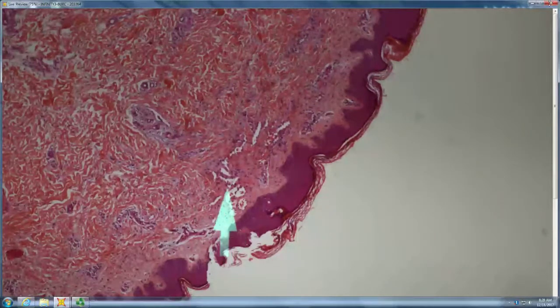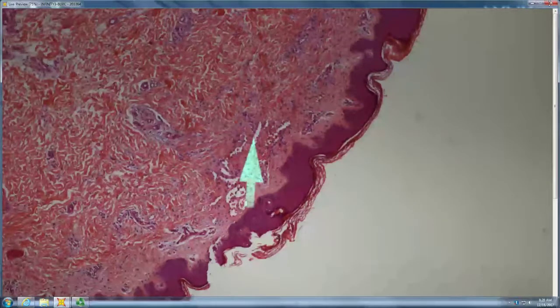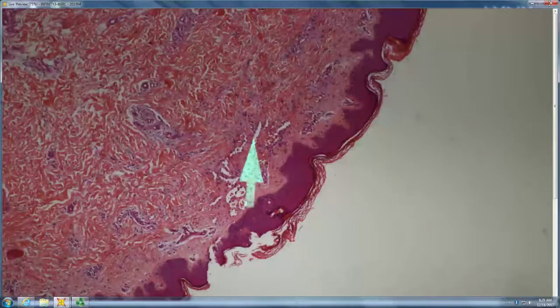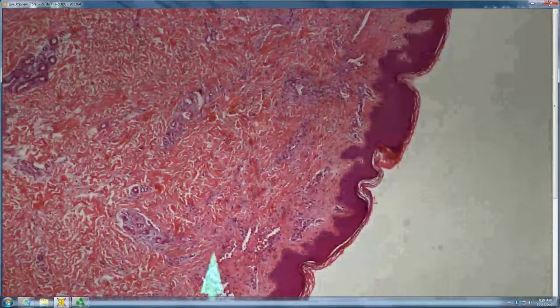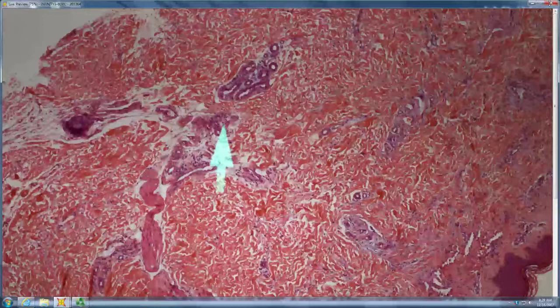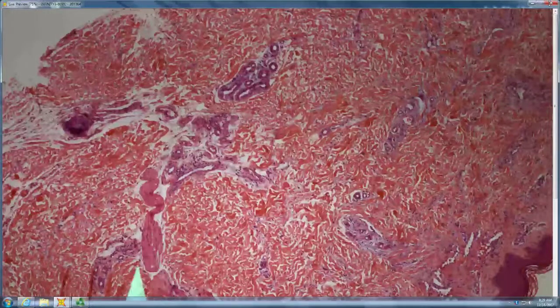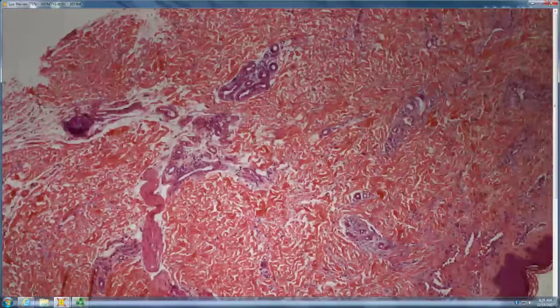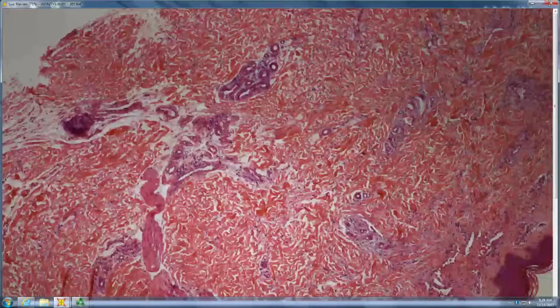Yeah, and what are those black things protruding into the vessel lumen? Like hobnail endothelial cells. So you have hobnailing of endothelial cells in a superficial lymphangioma-like configuration, but there's also a little proliferation deep. There's something going on around the arrector pili. Almost looks like capuches, where you have these little clefts around the arrector pili. So what would look like capuches deep and a hobnail lymphangioma-like configuration high? THH, targetoid hemosiderotic hemangioma. The other name for it is hobnail hemangioma.